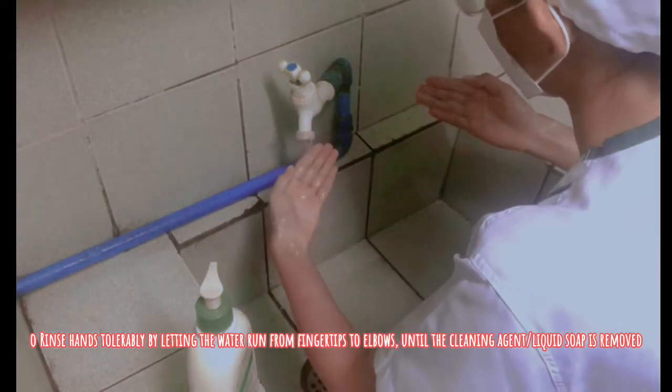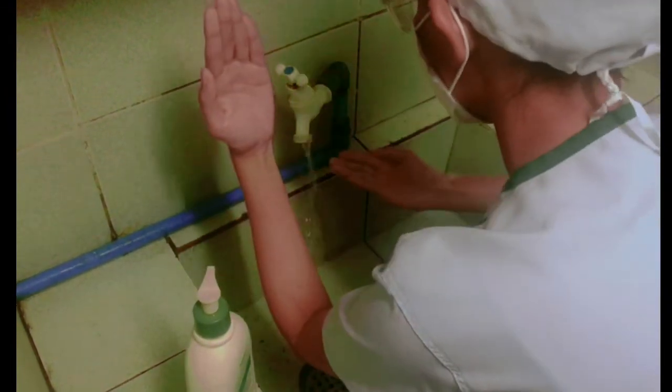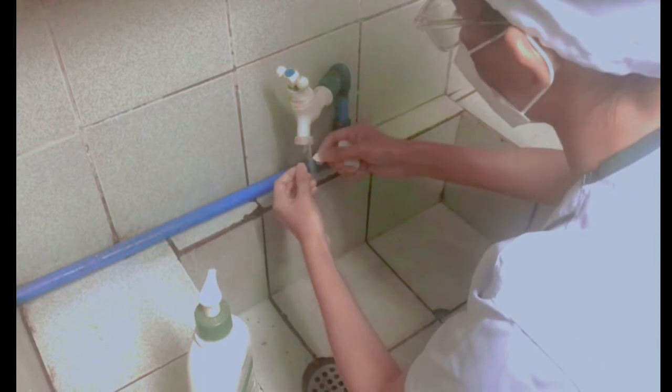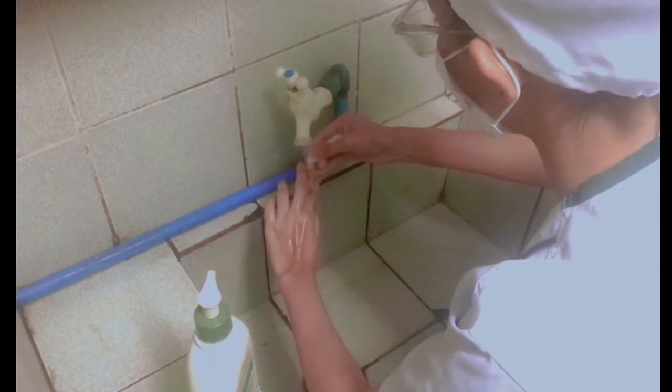To completely wash off microorganisms and liquid soap that has been used. Readying or preparing the brush and nail cleaner allows for saving time and a more organized way during the procedure. Using nail cleaner allows the removal of dirt under the nails.